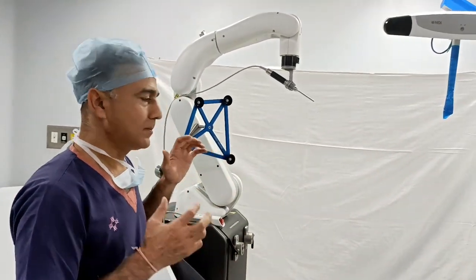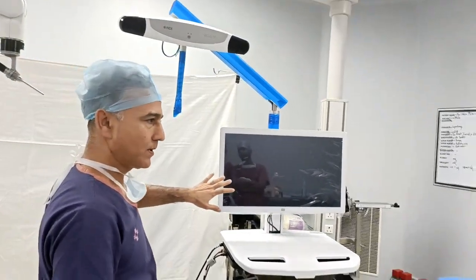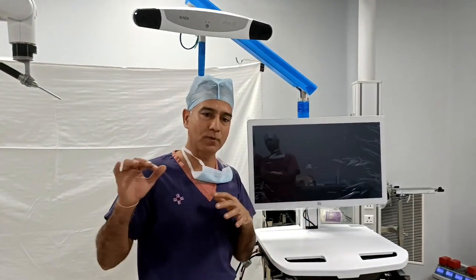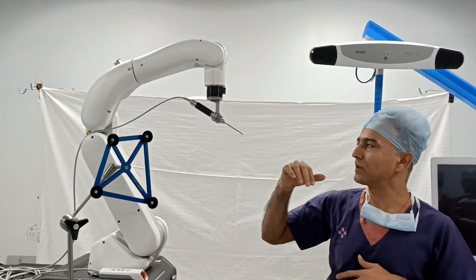We feed the patient's information and bone structure into the computer. This computer is connected to the robot. This is the robotic arm, and this is the burr that cuts into the bone.